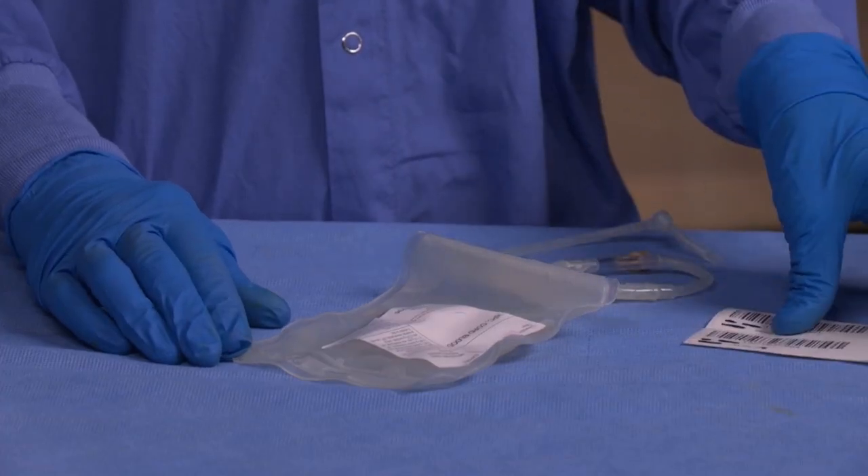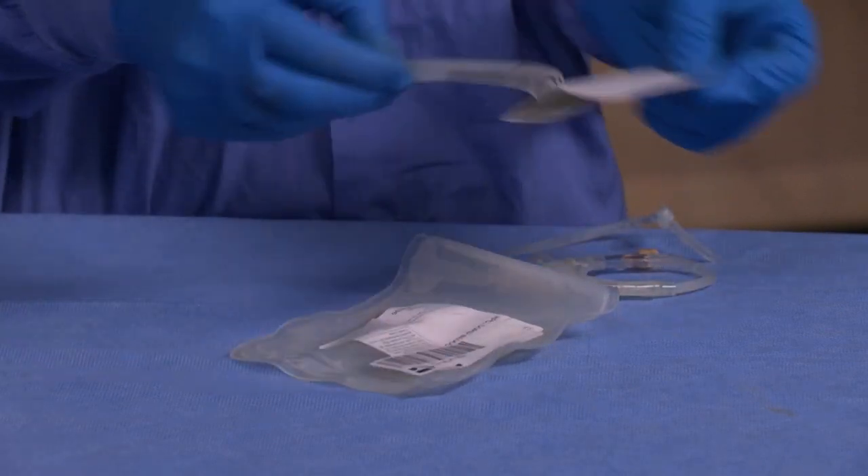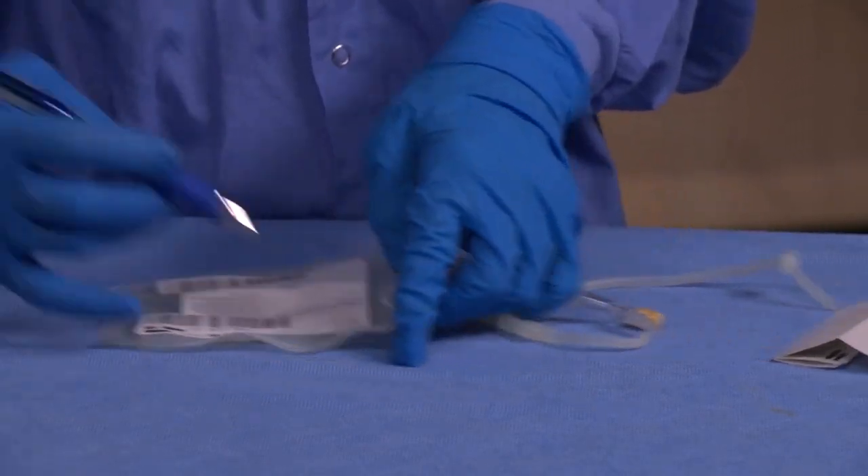Place an ID label on the cord collection bag for both the mother and for the baby. Both the date and time of collection need to be included on the label.